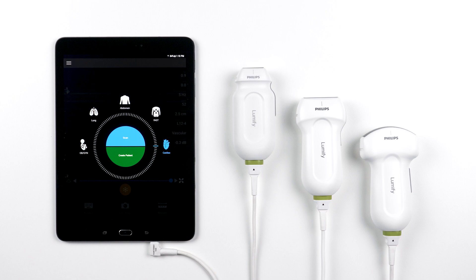In this video, we are going to go over all of the available transducers for your Lumify ultrasound system and discuss what sets them apart from other handheld systems.